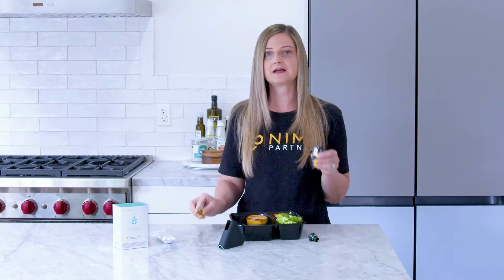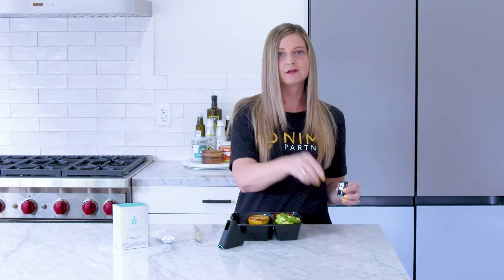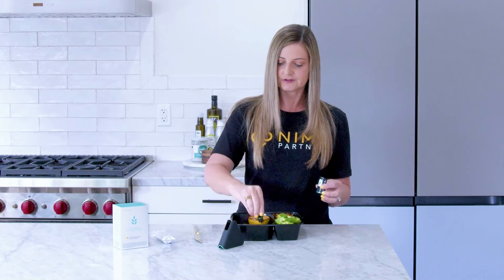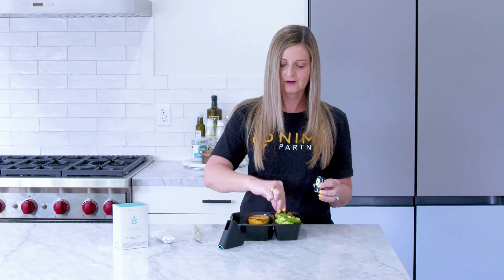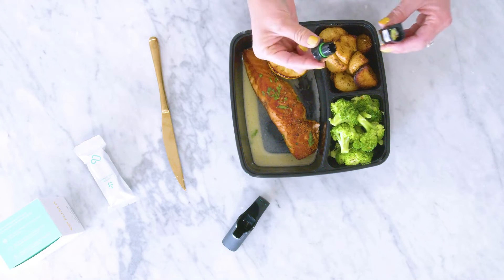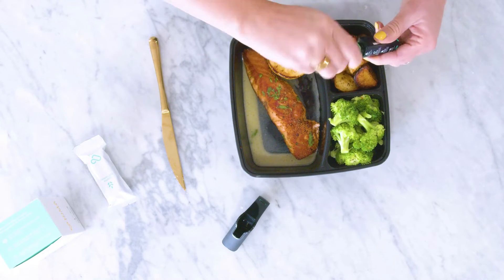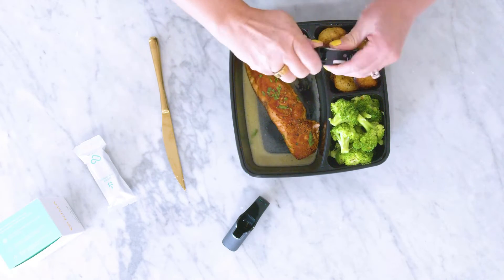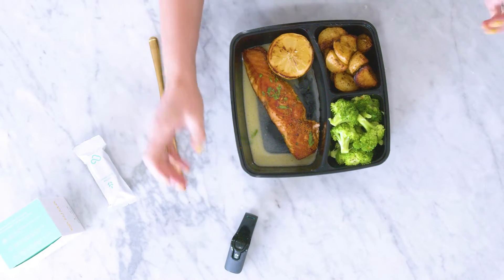We've got our pea-sized sample in here. Before I close my capsule, I'm going to use the cap of my capsule to go around and just touch areas of the food as much as possible, so I can get more of a sample from areas that I may not have gotten when I took my sample with the knife. I feel pretty confident — I've touched most of the areas of my food. I'm going to seal up that capsule and put it into my sensor and get that testing.